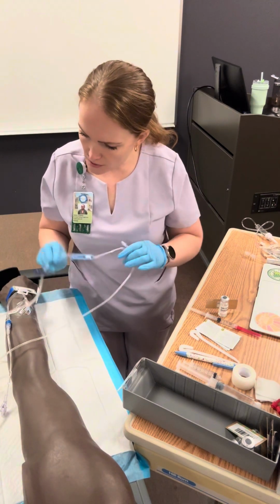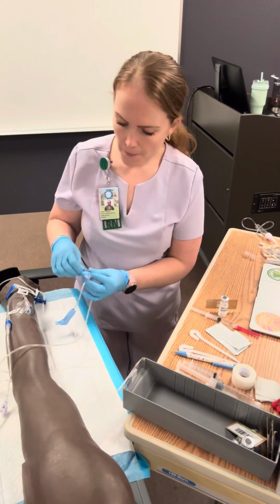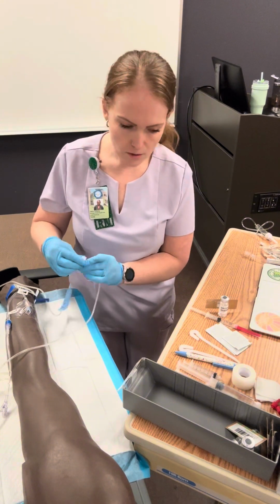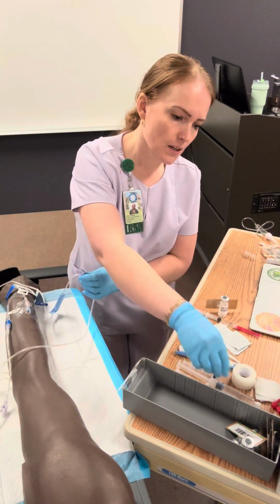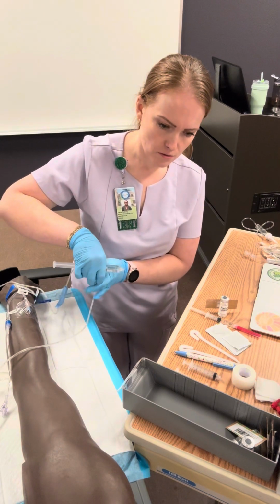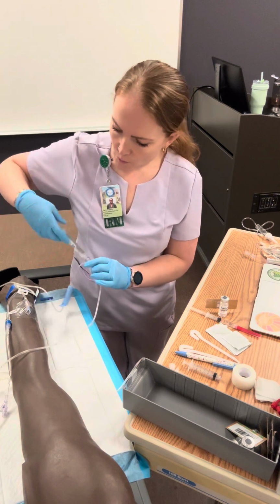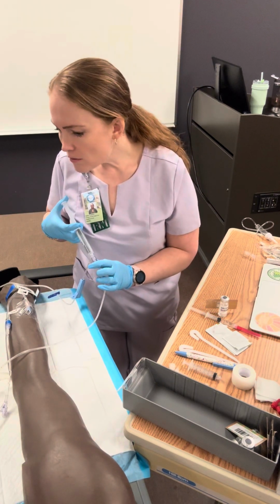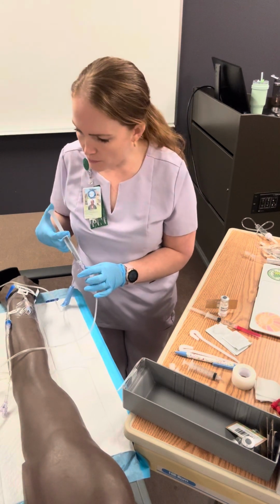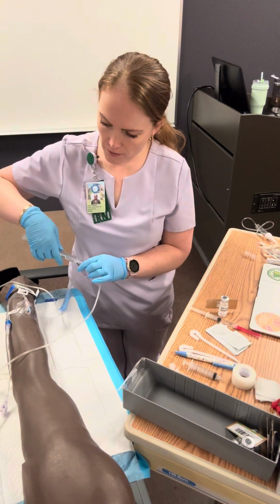The port closest to the body, I am going to clean very thoroughly, and we are going to take a flush. We are going to flush this through, looking for signs of infiltration and inflammation, making sure it's still patent and good to go. All right, that looks great.